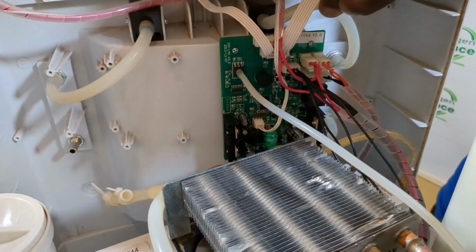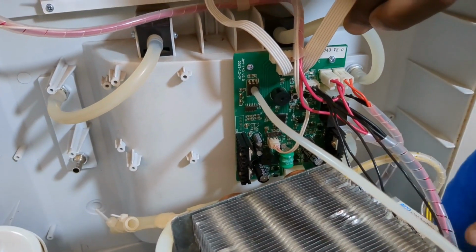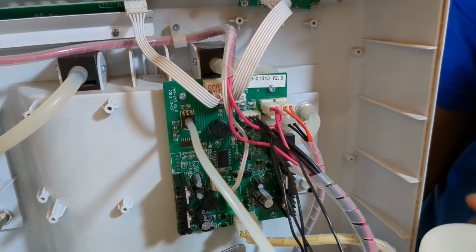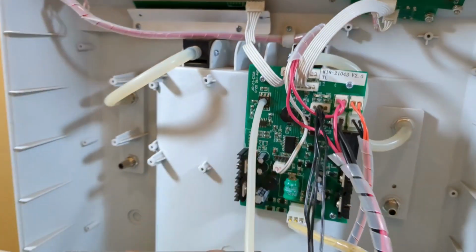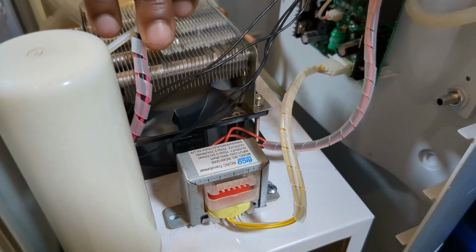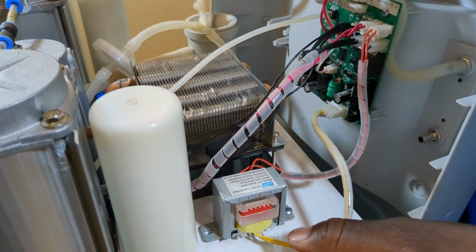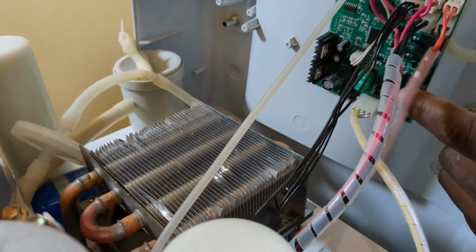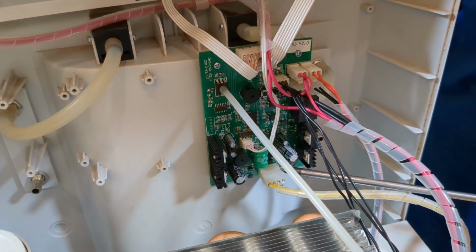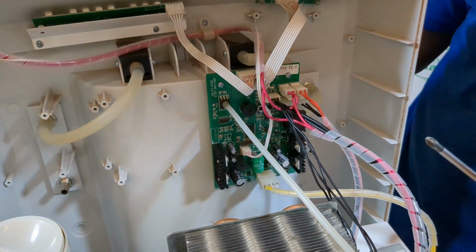So when you switch on the concentrator, all of these connectors will receive power, and these two black wires go back to the compressor. These two small black wires are responsible for powering the cooling fan, and these two orange wires are the inputs of this step-down transformer. This step-down transformer steps the voltage down from 230 volts to 15 volts AC, and the 15 volts is supplied to the board through this connector. From there, the 15 volts AC goes through the rectifying circuit, which converts it to DC voltage. And this DC voltage is used to power all the DC components on the board.